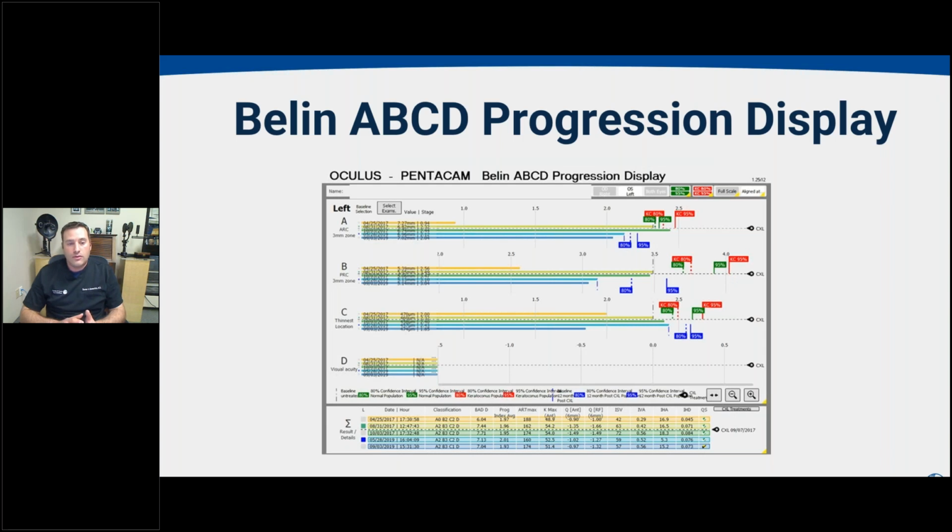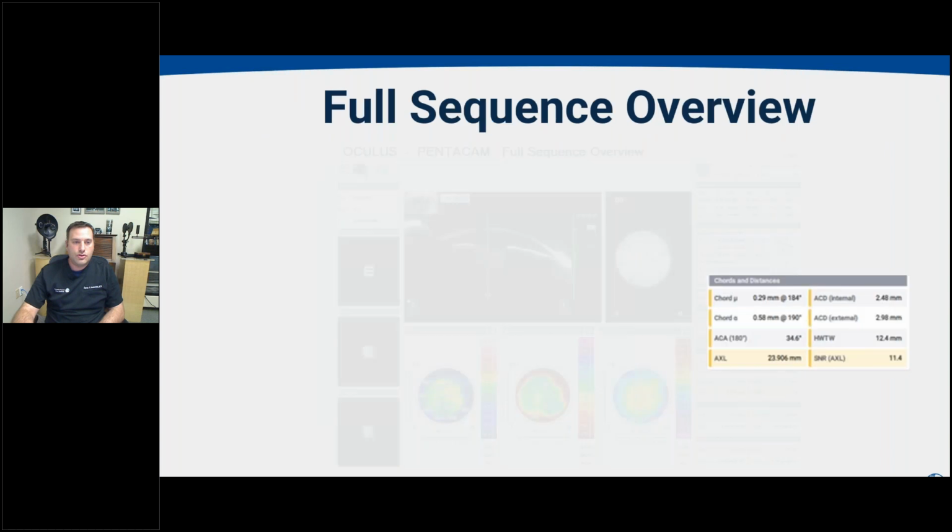And like I said, this has become very helpful. It makes it a lot easier for us to analyze progression in keratoconus for our patients who are young and post-cross-linking. But we do have patients who will progress even later in life, despite that being less of the norm. And as I said, before cataract surgery, ensuring that we have stability is really our most important parameter. Sometimes if we have to have our patients remove their contact lenses, particularly rigid lenses, we really do want to have a measure of stability before moving forward with our surgery.